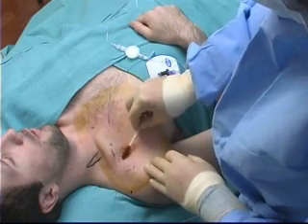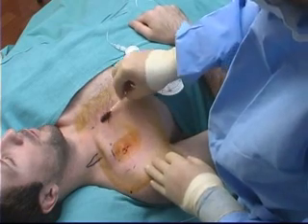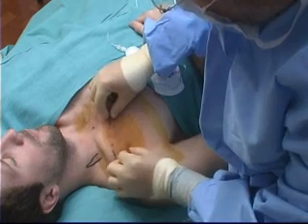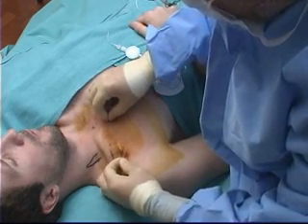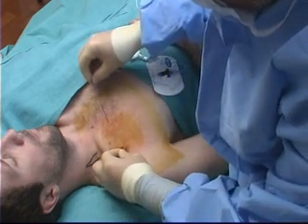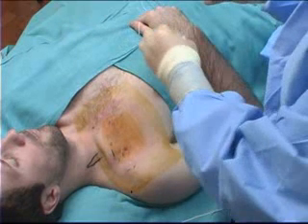Catheter removal is after the patient does not require the continuous block any longer and after full sensation has returned to the limb. Any radiating pain during catheter removal may indicate that the catheter is coiled around a nerve or cord, and this situation should be managed with utmost care. Remove the catheter by stabilizing the proximal part and first removing the distal end from the skin bridge. Once this is done, keep the catheter sterile and then remove the remaining catheter.